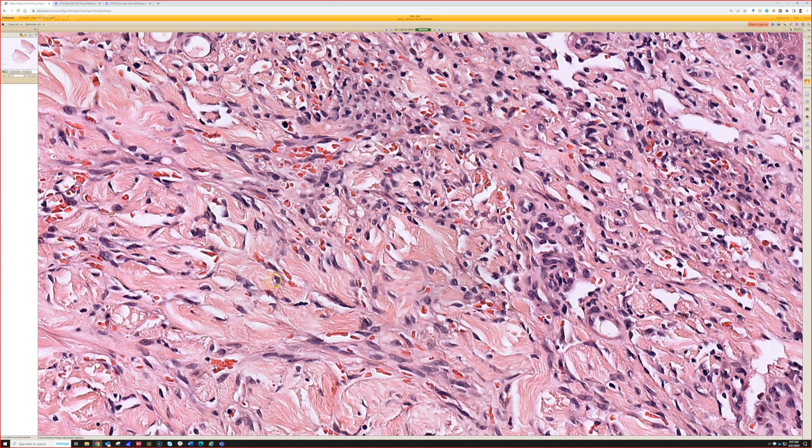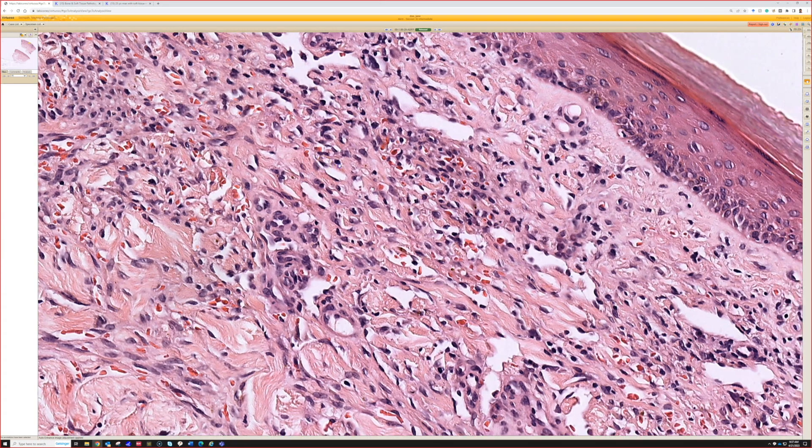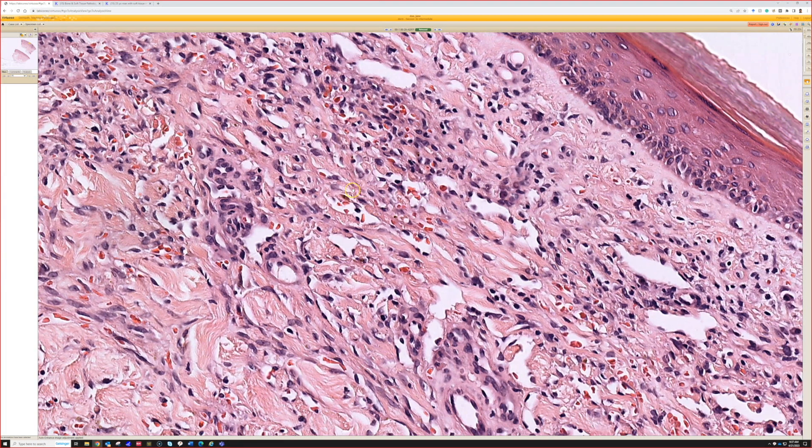We could always think: could there be angiosarcoma that's subtle? But what we're looking at here doesn't look very atypical. Most of the time, angiosarcoma has a lot of atypia, and Kaposi sarcoma doesn't have much. There are exceptions in both directions, but I would be much more in favor of this being Kaposi sarcoma.